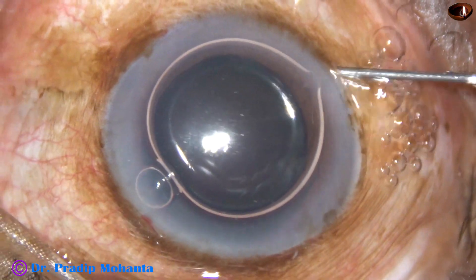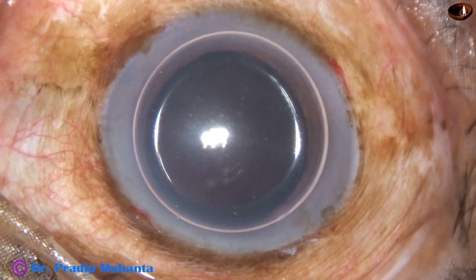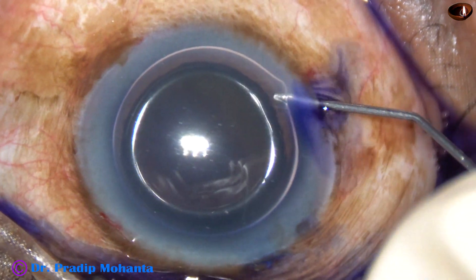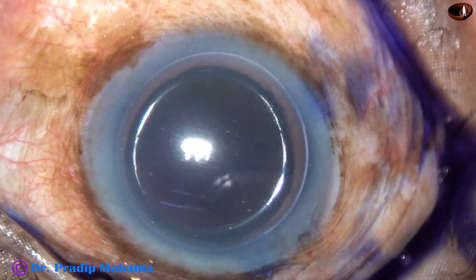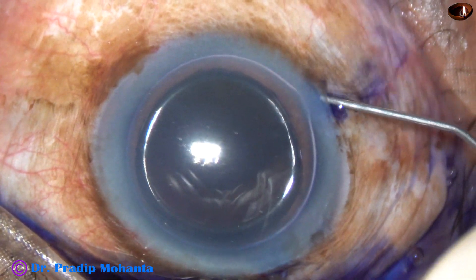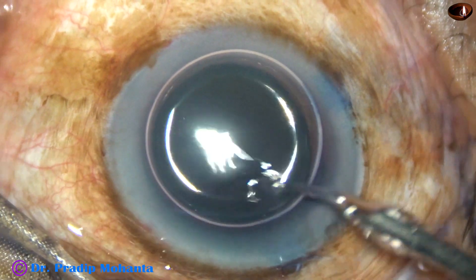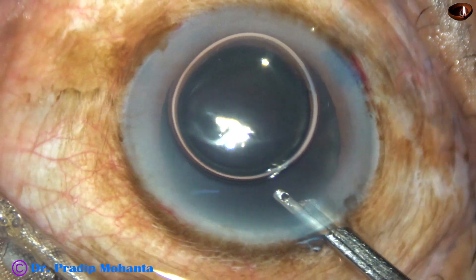And now, I want to stain the anterior capsule of this cataract with trypan blue dye underneath this air bubble. Here goes trypan blue 0.06% dye. And now, I am going to apply a little bit of adrenaline — this may help. If the pupil tends to constrict, I will be in grave trouble in this case. The dye is nicely washed out.